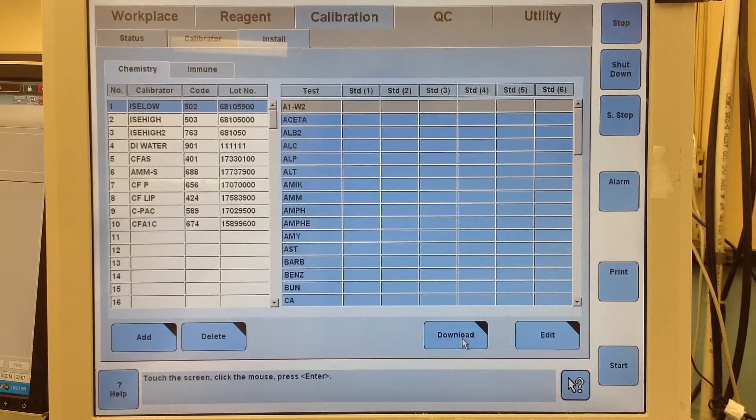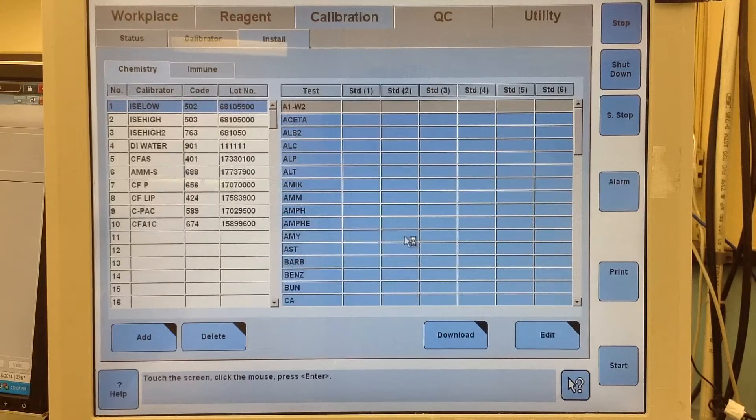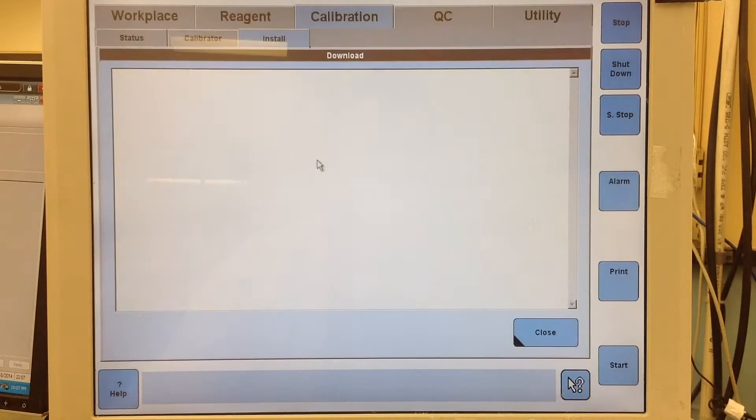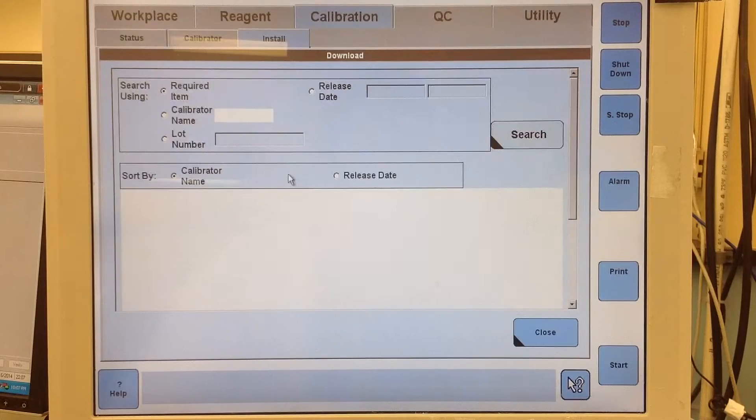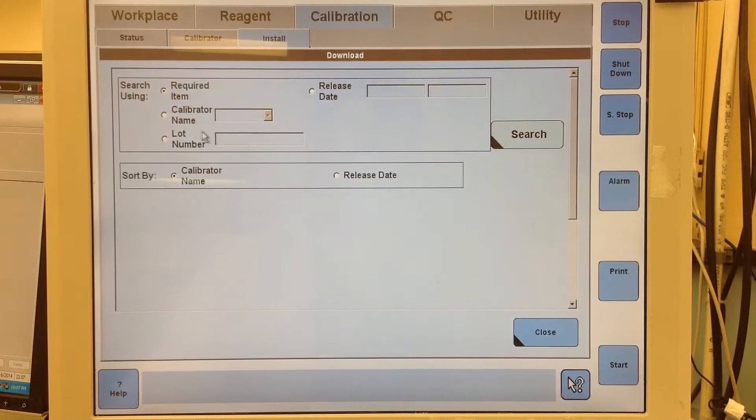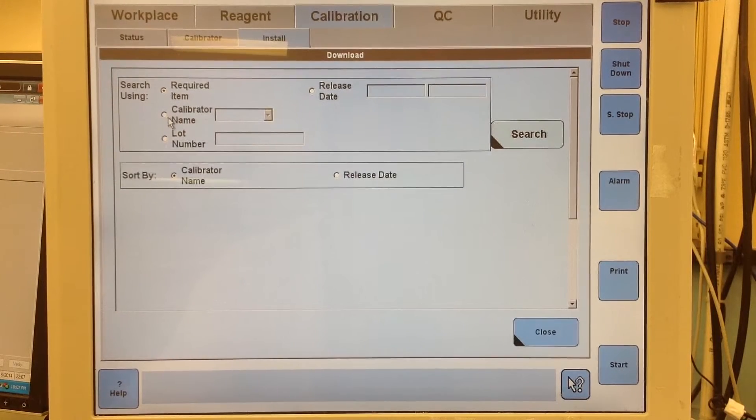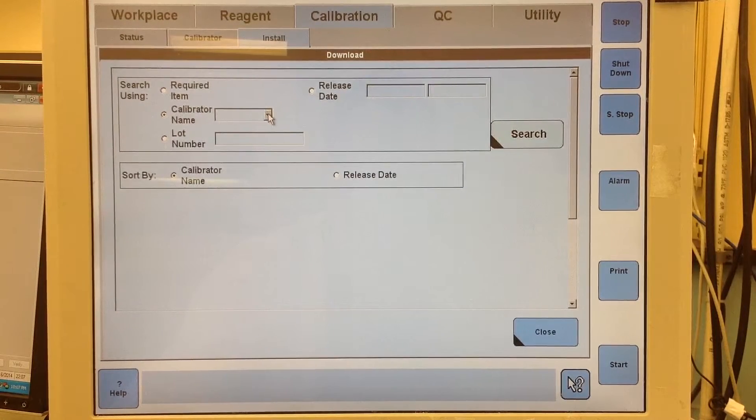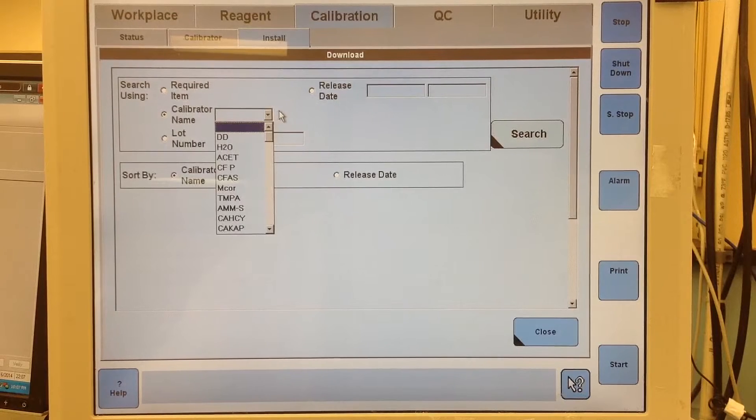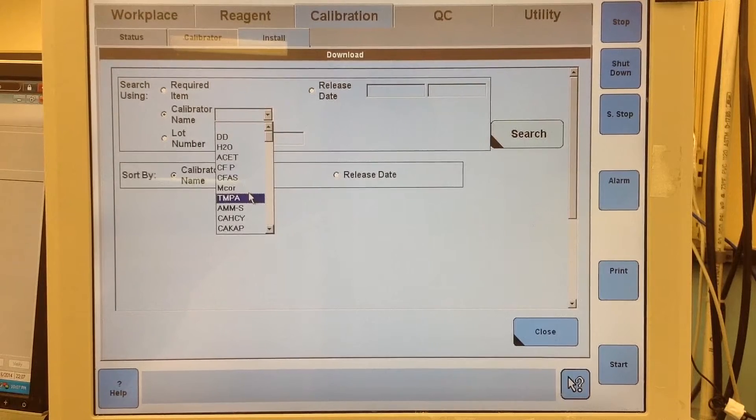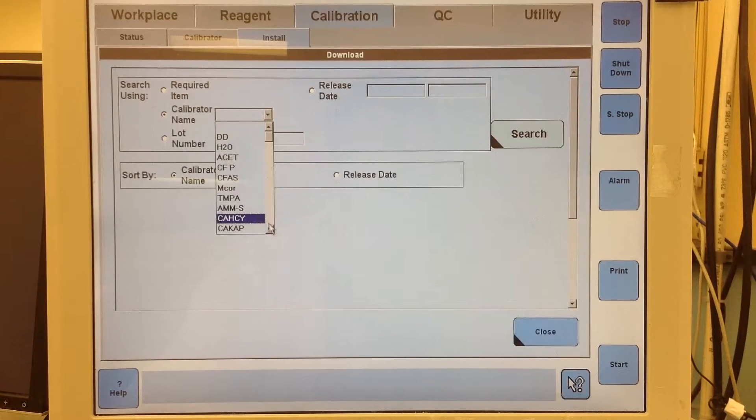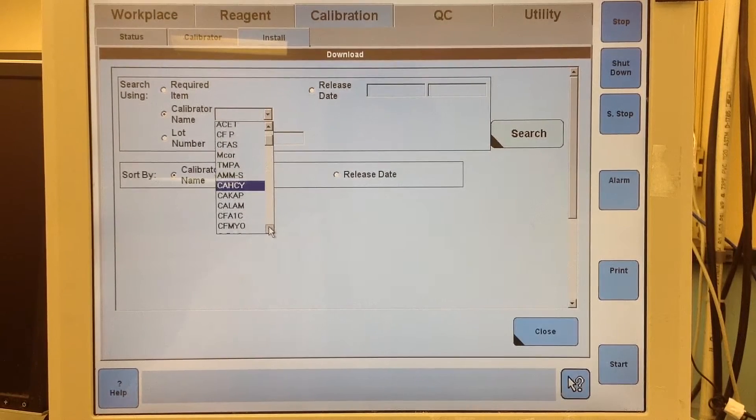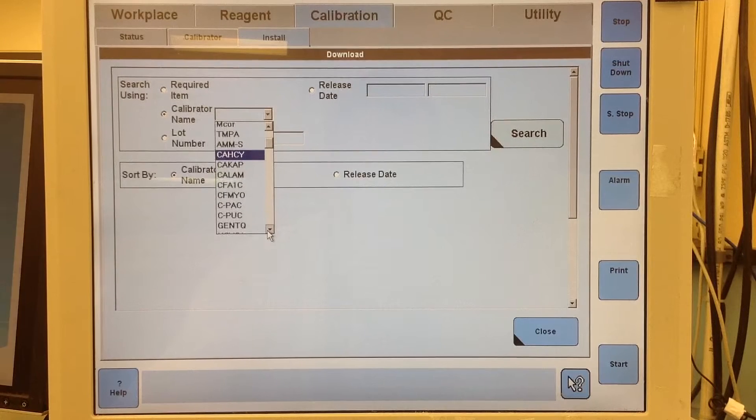Then I'm going to go to download. It's going to pop up with a new screen. Now I typically like to find the lots I have by going to calibrator name. Then you just go to the drop down tab and you can scroll through until you find the D-dimer calibrator.